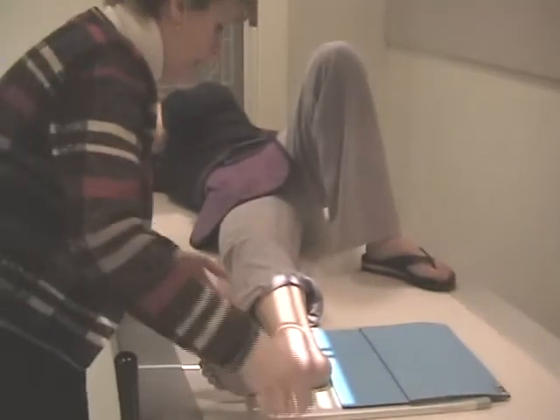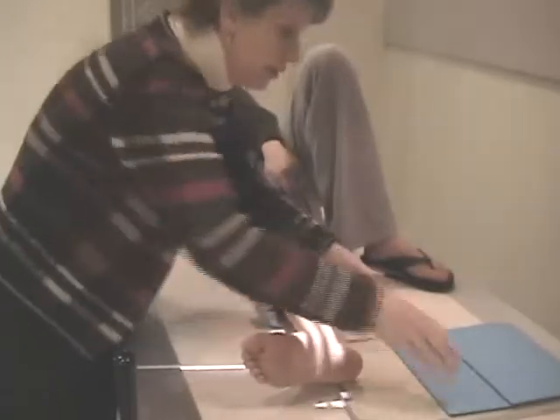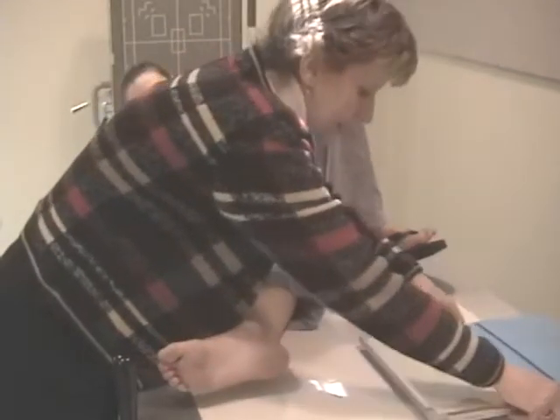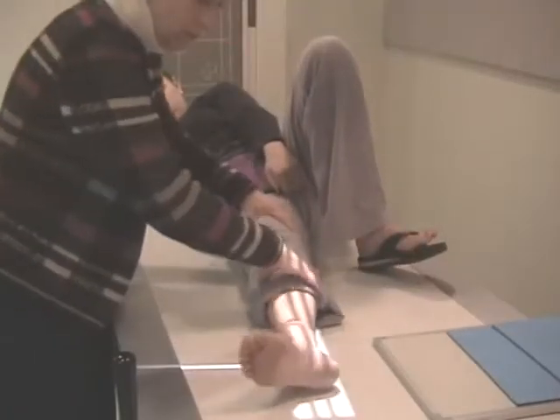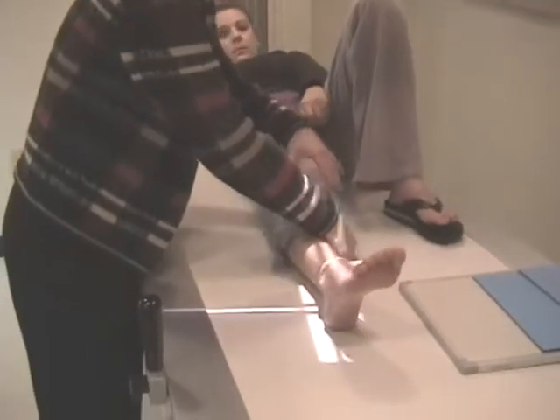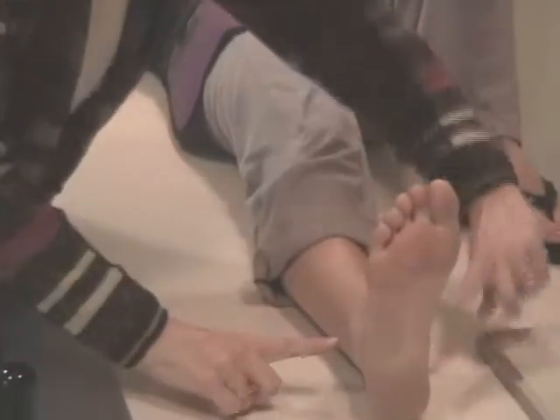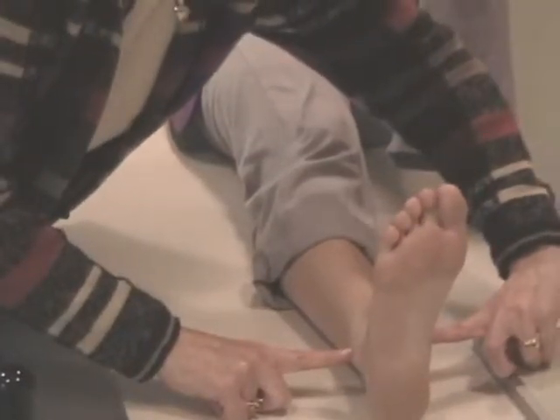And when you first start with the oblique, I'm going to move the cassette so you can see too. Many patients, instead of obliquing the foot and the ankle, this is what you want: foot flexed, intermalleolar line parallel.